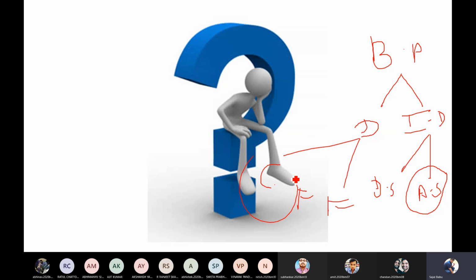In the catheter tip type, you have a sensor at the tip of the catheter. Whenever you insert the probe into a blood vessel, the sensor at the tip will measure the blood pressure and convert it into an electrical signal, and this signal will be amplified, filtered, and then displayed or recorded. And what happens in the fluid filled type? Whenever the probe is inserted into the blood vessel, the pressure exerted by the blood is exerted on the fluid, and the fluid transmits the pressure externally, where a transducer converts it into an electric signal, which is again amplified, filtered, and then displayed or recorded.